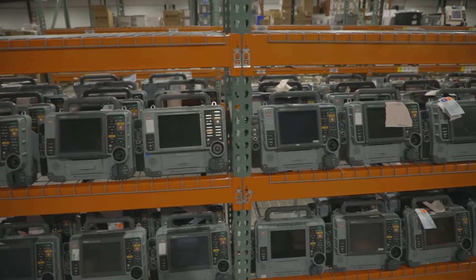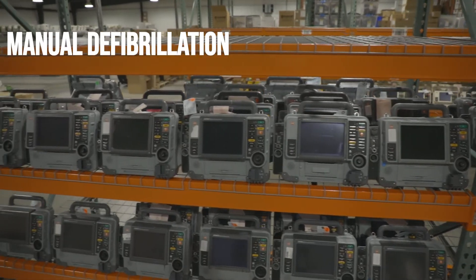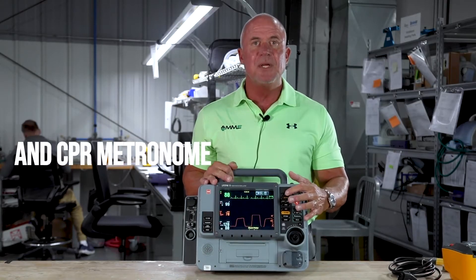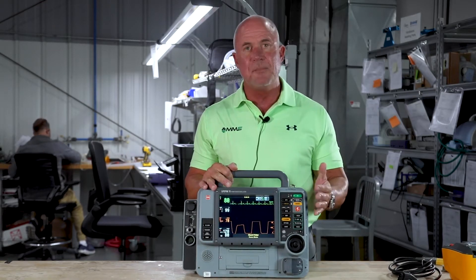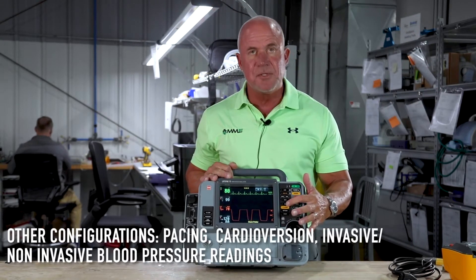We offer this monitor in a lot of different configurations, including manual defibrillation, an AED mode, a CPR metronome to help guide you to properly ventilate your patient without hypo- or hyperventilating, pacing, and synchronized cardioversion.